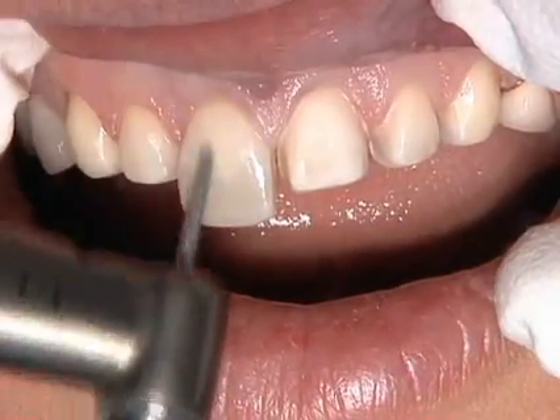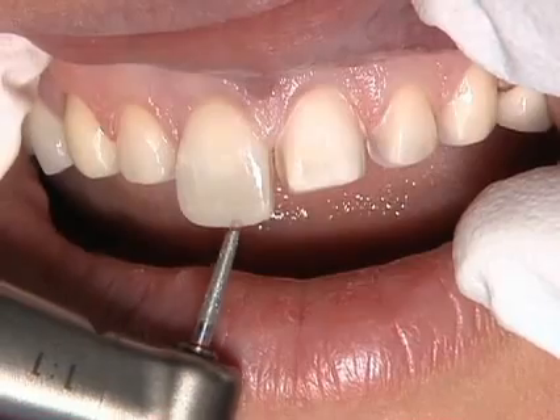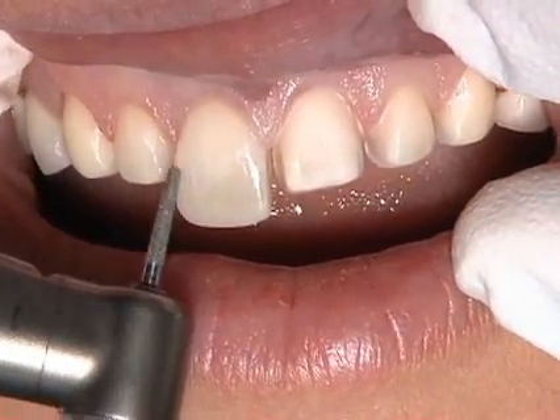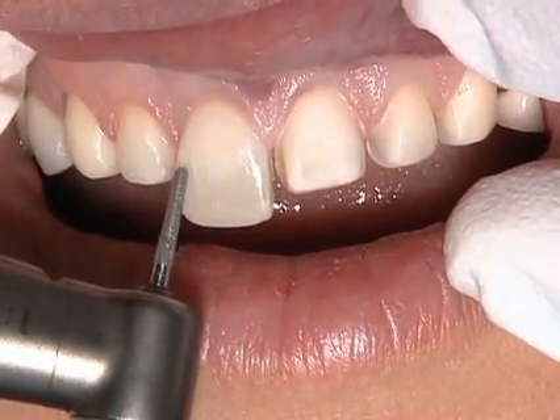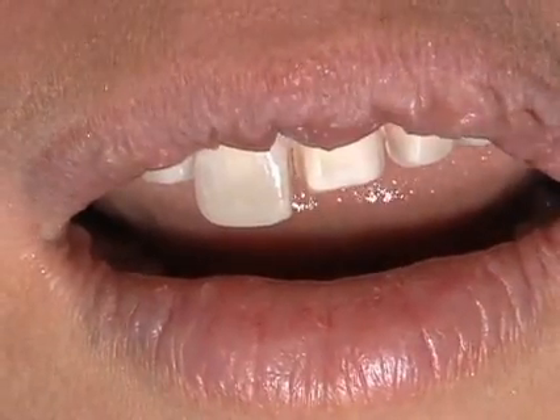At this point we still have one tooth that has not been prepared, so we have a reference in length. It's a safety precaution for those who want to try the technique — it can be very effective. You can double check length and facial reduction.